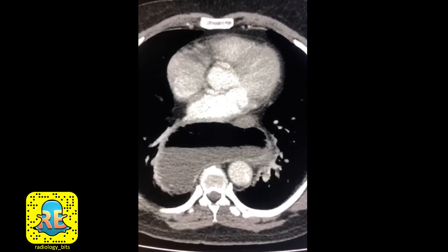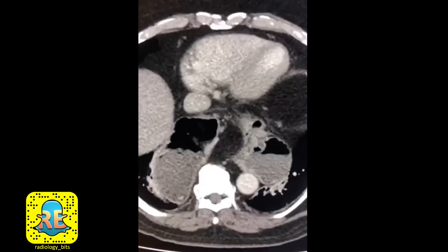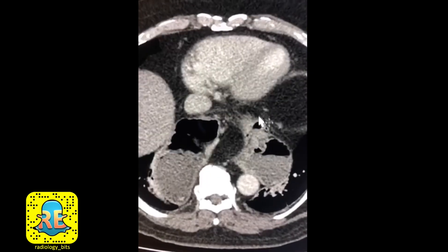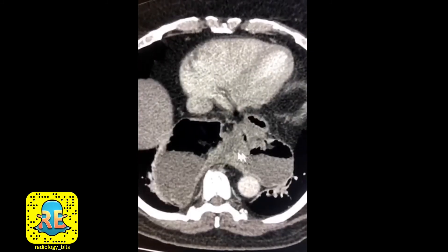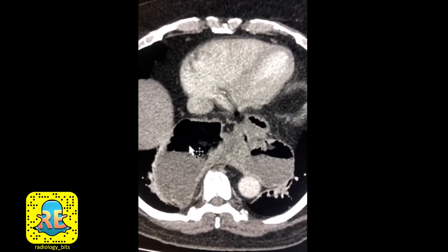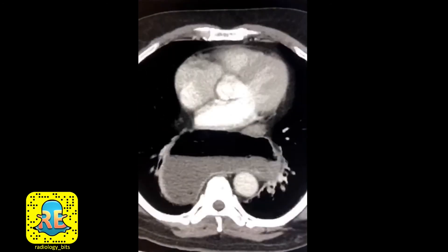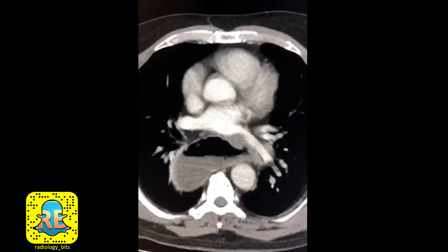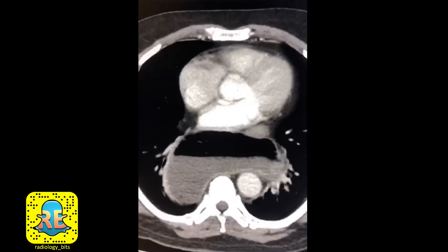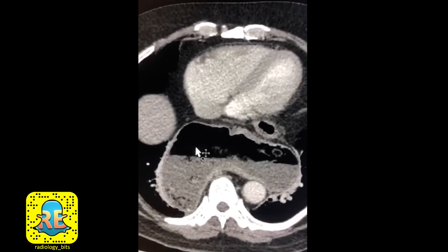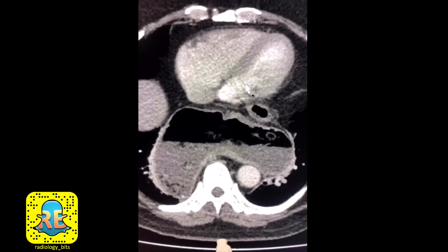Continuing through the slices, you notice a tubular structure representing the esophagus, then the gastroesophageal junction, which connects to a structure that continues back down again. Most of the stomach is within the chest. This is a hiatus hernia with a large intrathoracic stomach, and that concludes today's case.